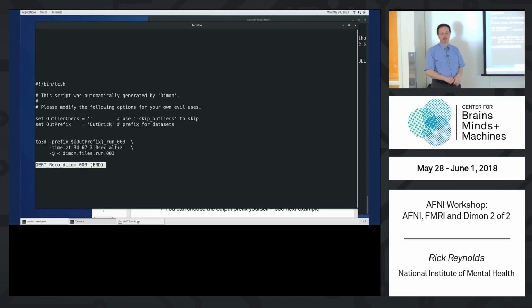Yeah, it's the same. I think it's T0. Yeah, T0. Or is that 3D T shift? I don't know. Anyway, so you can look it up and make sure of what you're doing. Any other questions about this?